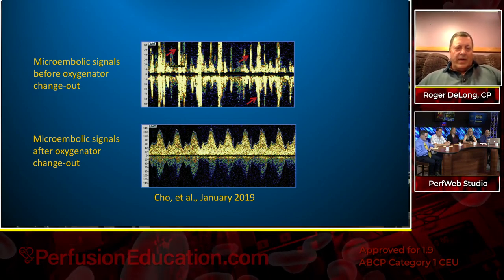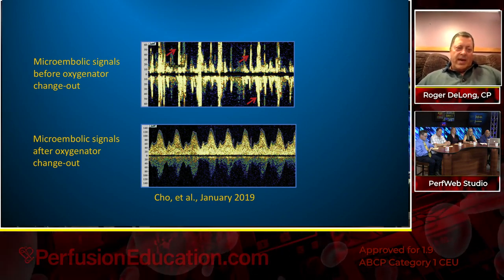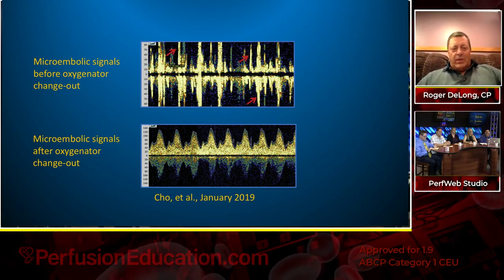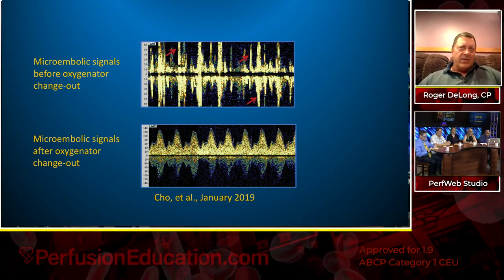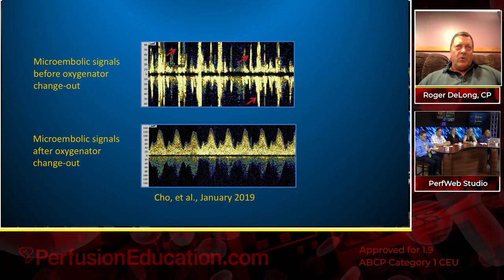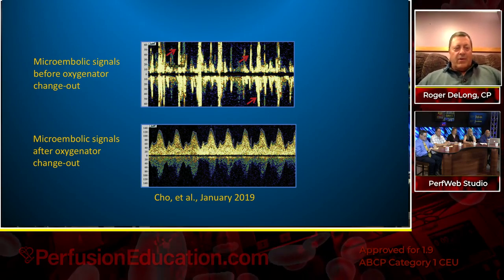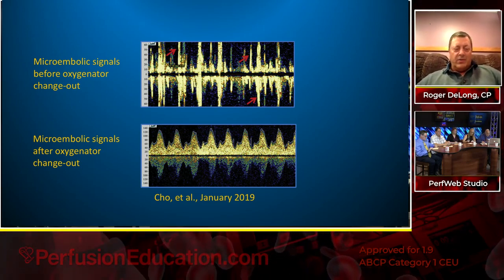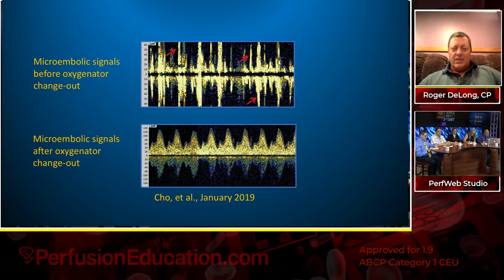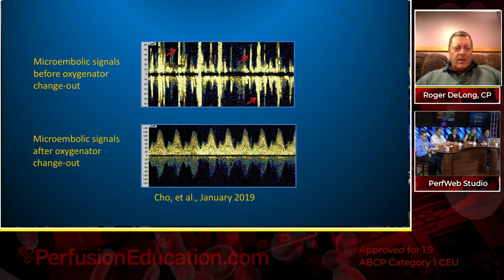And this reading is taken right off the middle cerebral artery, so he's getting quite accurate information that something's going on there. So are we doing the right thing by anticoagulating patients? We're trading possible cerebral hemorrhaging for known cerebral microemboli. Is our tipping point at 180 to 200 seconds a good one? The jury's still out, but studies like this will go a long way to making some headway for it. Next slide.